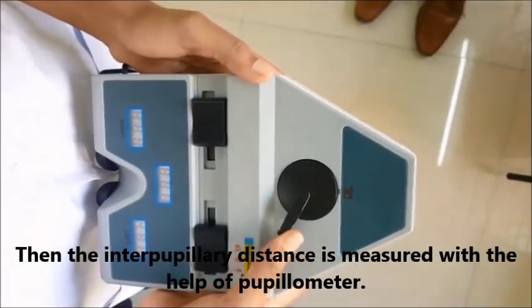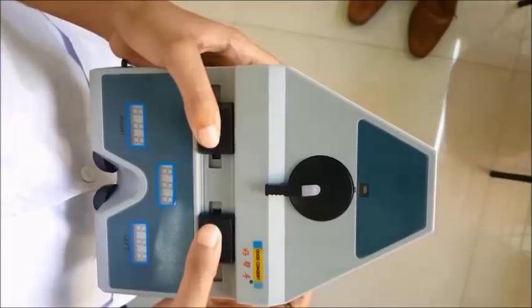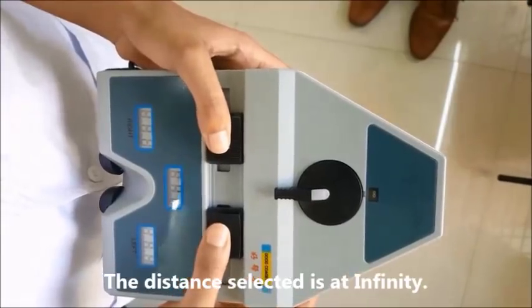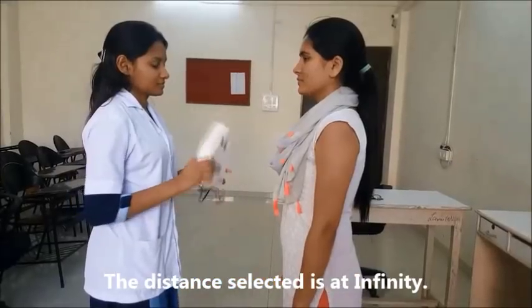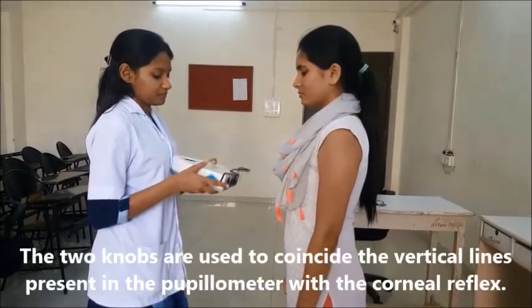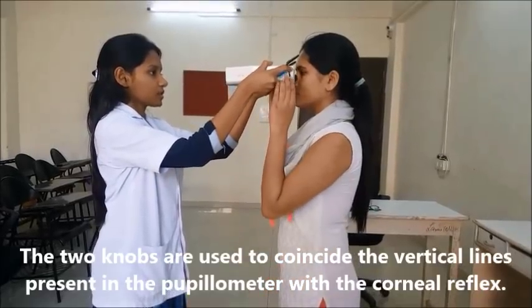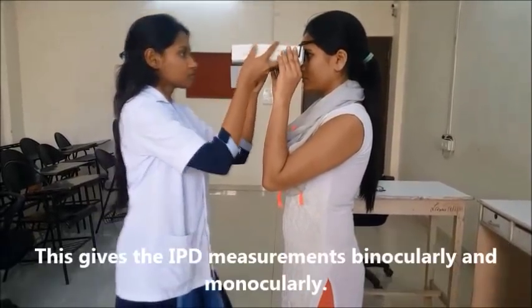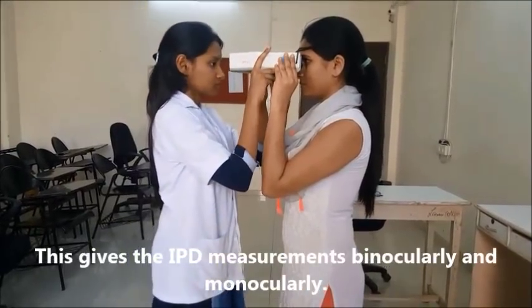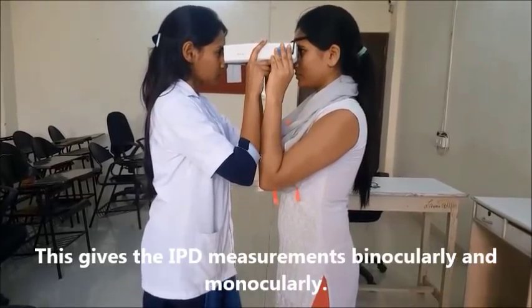Then the interpupillary distance is measured with the help of the pupilometer. The distance selected is at infinity. The two knobs are used to coincide the vertical lines present in the pupilometer with the corneal reflex. This gives the IPD measurements binocularly and monocularly.